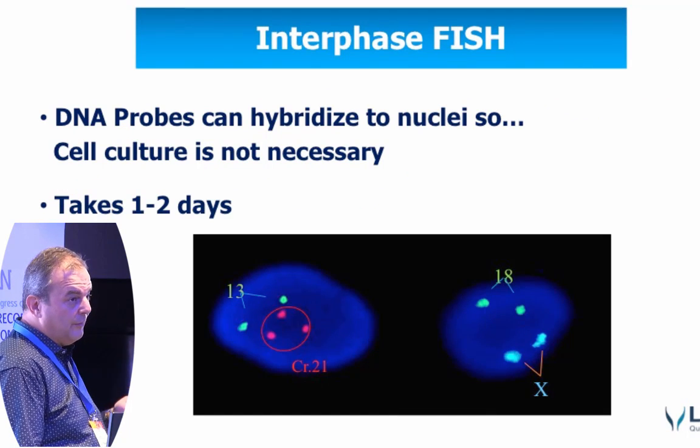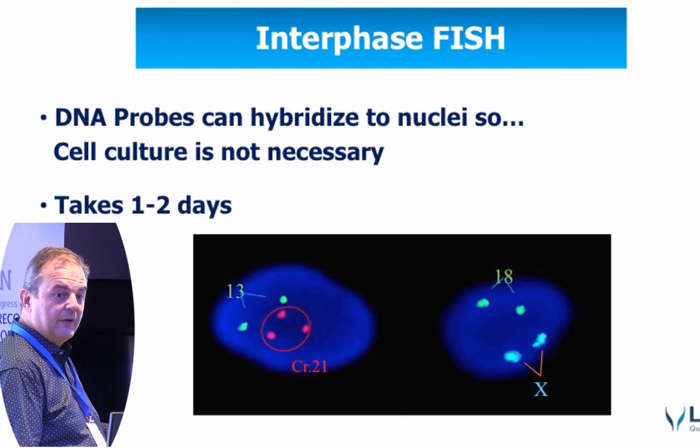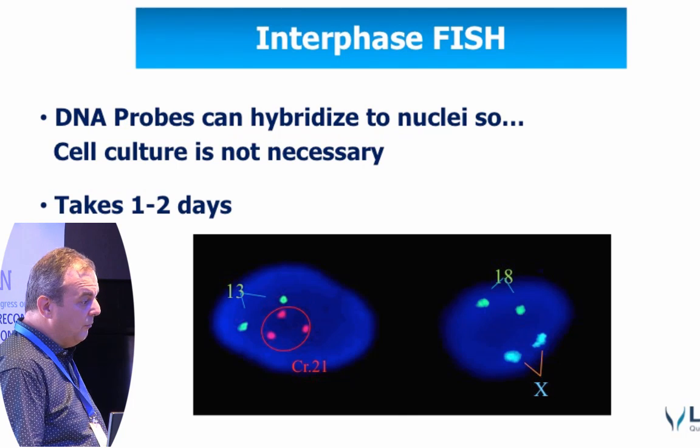The good thing for prenatal diagnosis is also that probes work very well in interphase nuclei, so you can use the direct fixed samples instead of waiting a couple of weeks for chromosomes to be visible. So this can be done in 1 or 2 days.